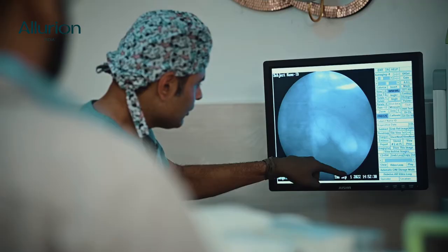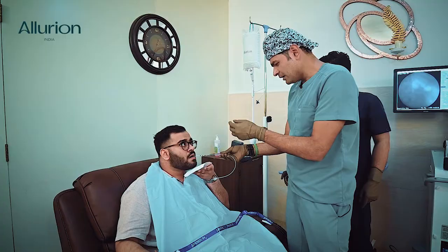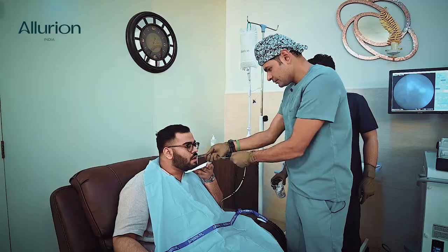We'll put a cap over your catheter so that the fluid does not come out — it's a complete 550 ml. Take an x-ray. You can see that this balloon is completely full, and there is a little amount of air which is the air of the body. Now we'll remove the catheter — you might feel a little bit of a tug, that's fine. Take deep breaths. Done.